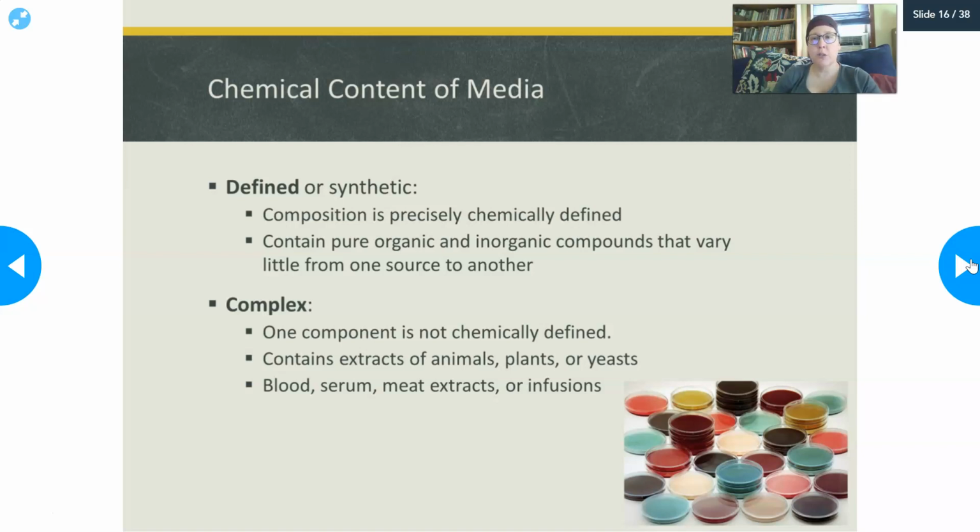And maybe you're just looking for the presence of some bacteria like Salmonella or Shigella that would cause a problem, but you're not interested in all the other guys that are supposed to be there in the first place. So there's ways to select the right media where you're blocking the growth of everything else and only encouraging the growth of Salmonella and Shigella if they're present, for example.